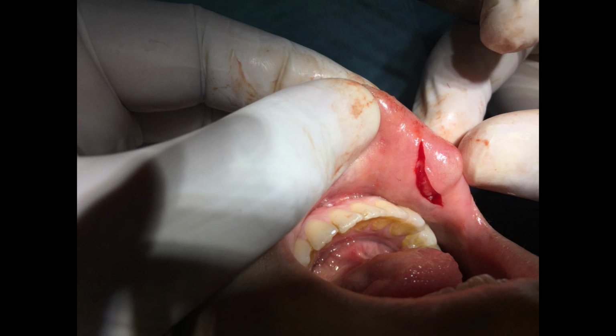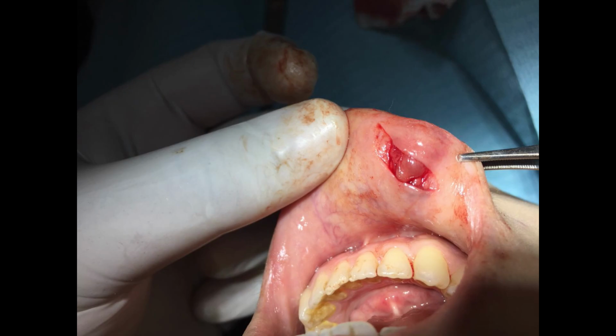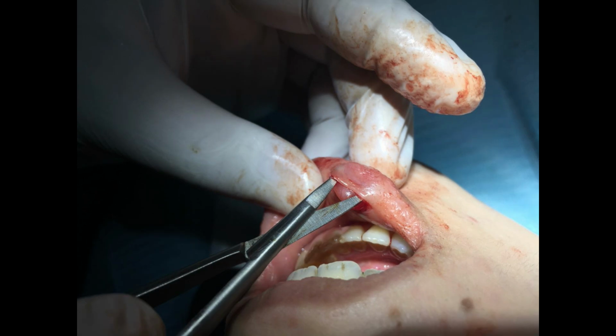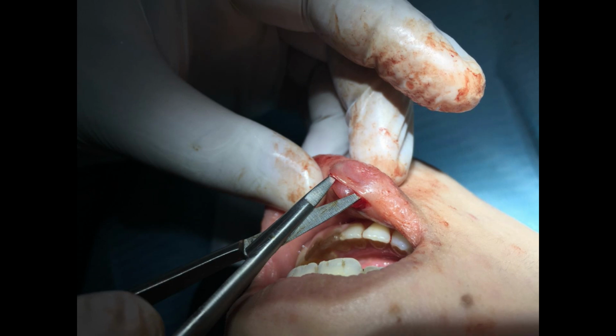As the elliptical incision was made, we were able to access the swelling, and then the swelling was detached from the underlying tissues with the help of a scissor. The scissor was used in a closed manner, advanced inside the soft tissue, and then opened. The purpose was not to damage any structure underneath, but to separate the mucocele effectively from the soft tissue that was surrounding the mucocele itself.